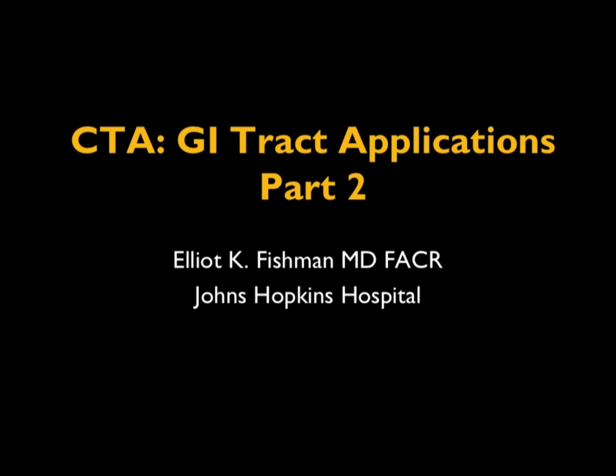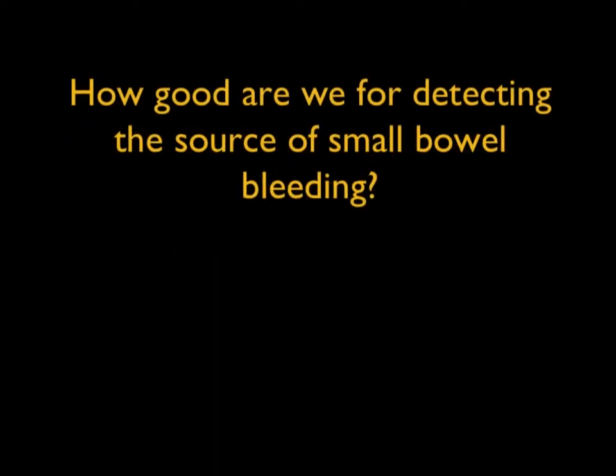And let's get started. And let's start with GI bleeding. GI bleeding is something that CT excels at, and we see more and more patients who present with this problem. And again, how do you manage GI bleeding? Forget we're radiologists. Should you go to endoscopy, colonoscopy? What should you do? Should you do CT, nuclear medicine? What is it you should do? Well, let's talk about that.